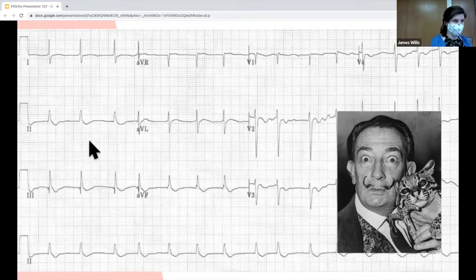So they have an increased vagal tone, which can cause, if they have a P wave, PR prolongation. They get this characteristic Salvador Dali sagging ST depression. Their T waves can do whatever they want. And they do have a shortened QT interval. There's many other findings, but the most important thing we all think about is the sagging Salvador Dali.